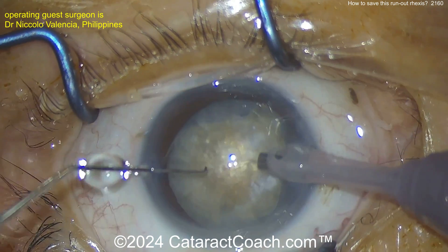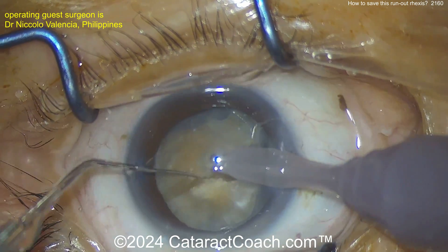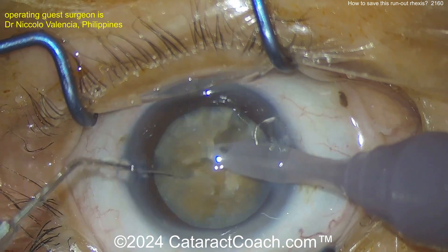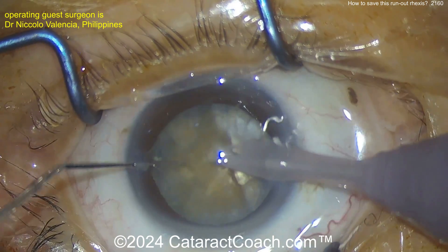Here's a chopper. You want to be gentle in that bag — don't do too much maneuvering, because you don't want to rip all the way back to the posterior capsule. Bury the phaco tip and do a vertical type chop. Do it again and again.